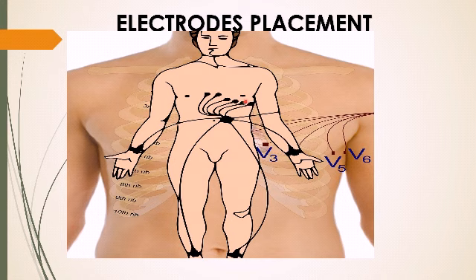Now let's see C5. We say you place it at the same level as C4, but at which position? This is the armpit, or the axilla. The axilla is the armpit. Just at the anterior edge of the axilla, or anterior axillary line. That is where you place C5.